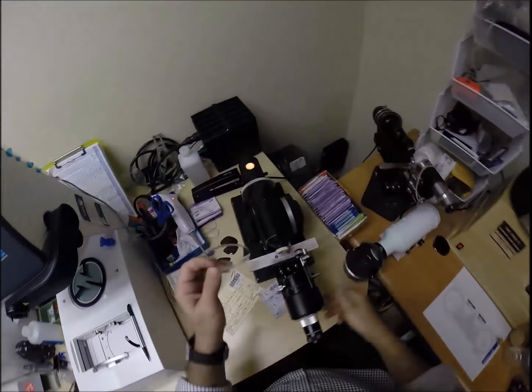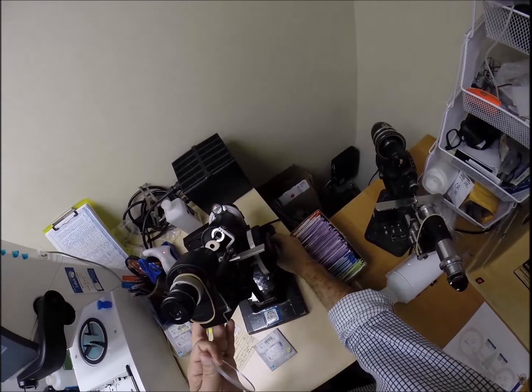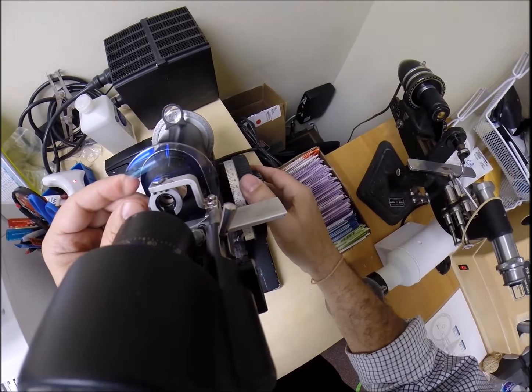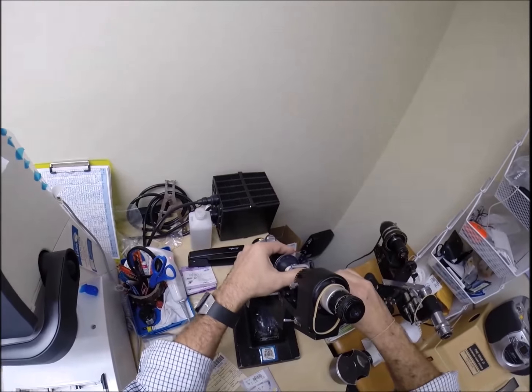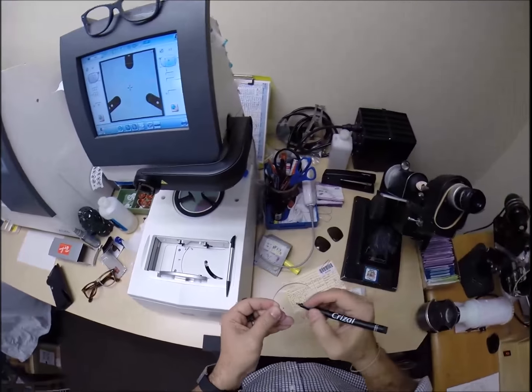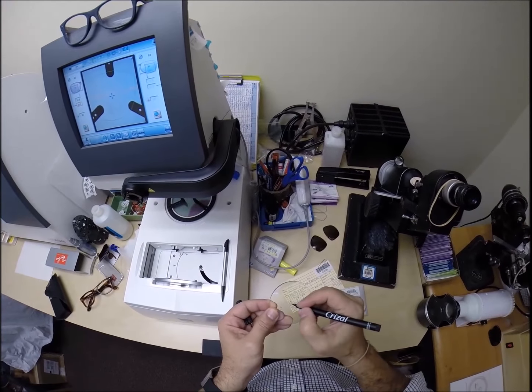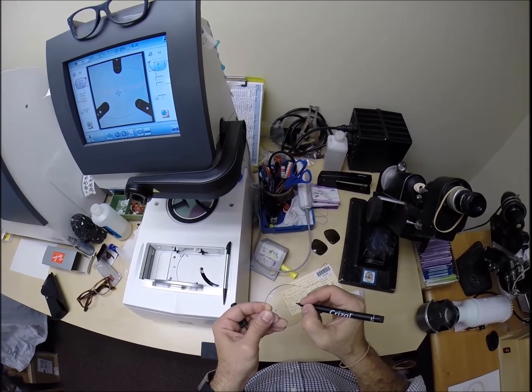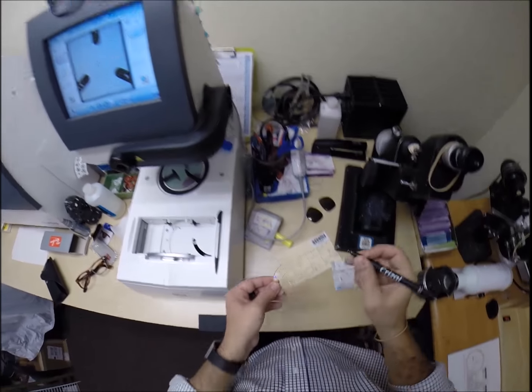Start all over again. Raise that back up, lock it down, put the lens in, check everything is lined up. Now let's put 3 dots on your lenses, and that center dot better show up. There we go. It's not happy about it, but I'm going to darken it. Come on now. My ink isn't meshing. And then there's that one. Of course, this is the right lens.